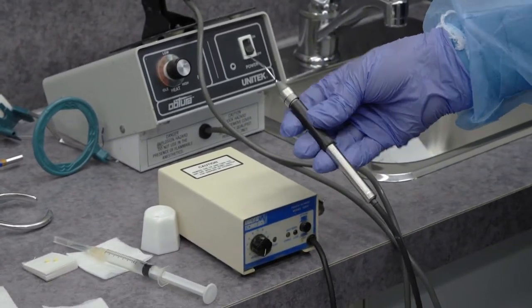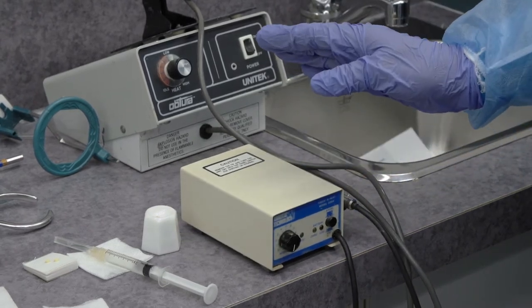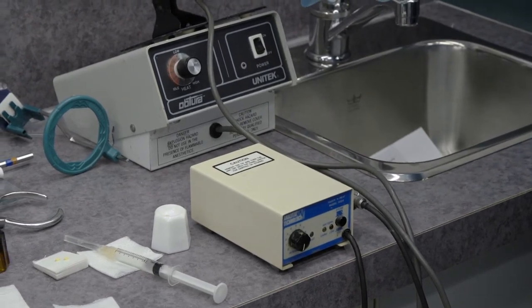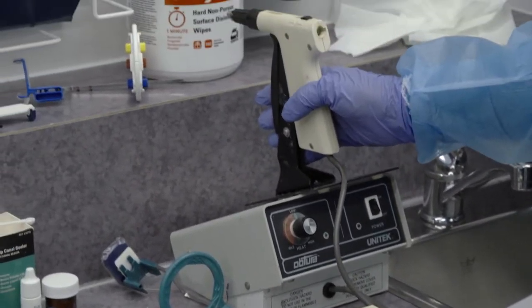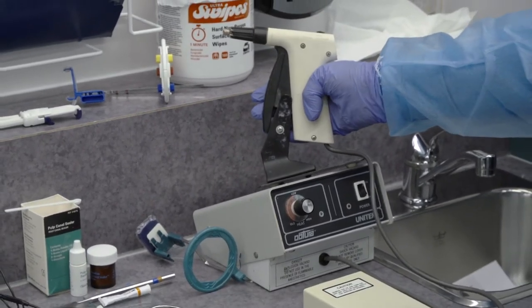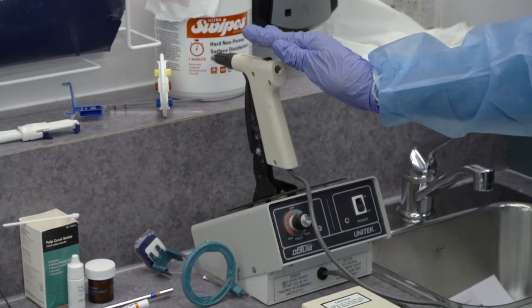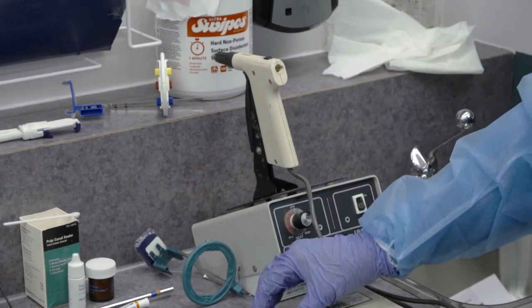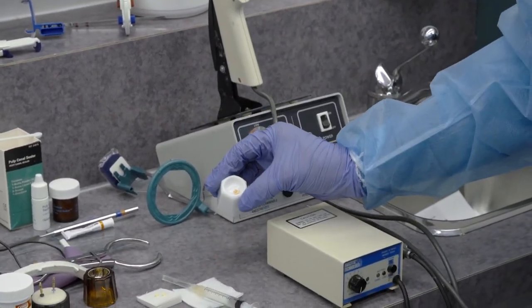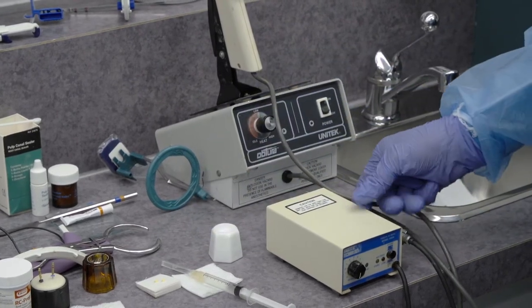gutta percha and for backfill if you're using gutta percha. And talking about that, with the gutta percha for backfilling, we have a gutta percha gun. There are different kinds. You have gutta percha pellets that are placed in the gun to utilize for backfill. We'll utilize this instrument to show you what backfill looks like. Some offices may, for the backfill, instead of using a gun, use cut up pieces of gutta percha that you would heat up by utilizing the touch and heat.